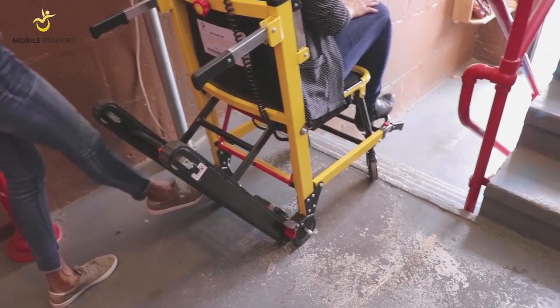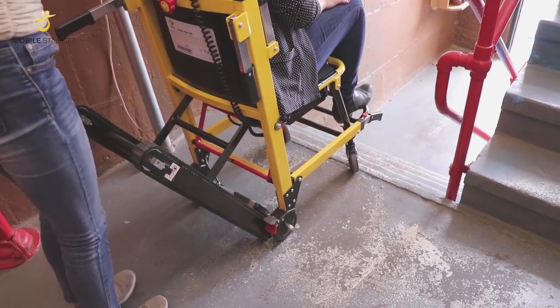Finally, always ensure the wheels are locked before you ascend or descend a staircase.